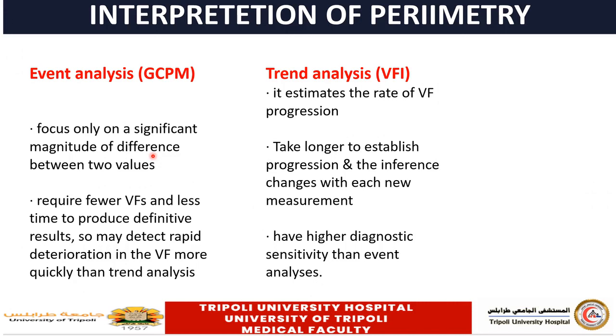However, the trend analysis will require a long time because it determines the progression, or the speed of the progression, of the disease. It requires longer time to find this relation. However, the trend analysis has higher diagnostic sensitivity than the event analysis as far as medium and long term.